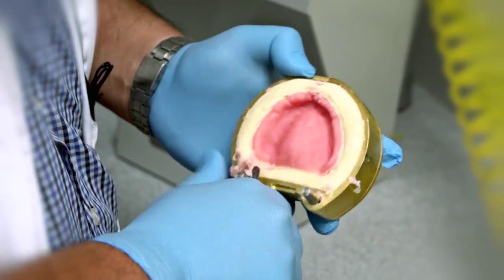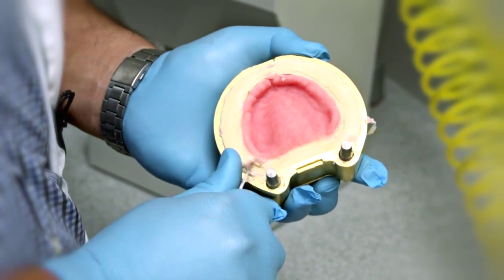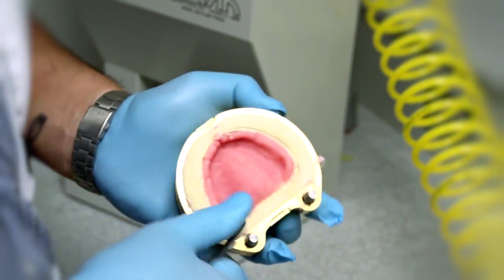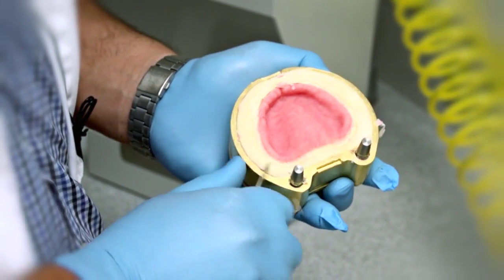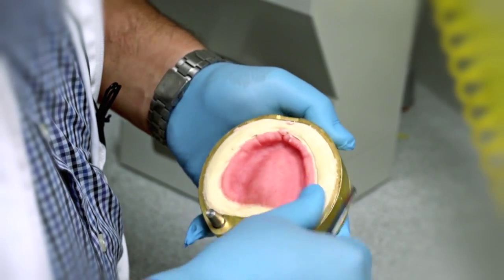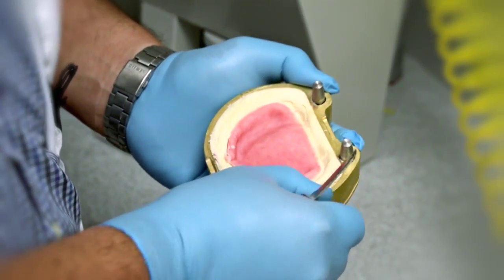The handling characteristics of super high impact here are very similar to regular acrylic. The differences are very minute. You do not have to change your protocol for the way that you invest or anything, although I do process my cases overnight. When I do not use an injection technique, I process these cases overnight at 163 for 8 hours.